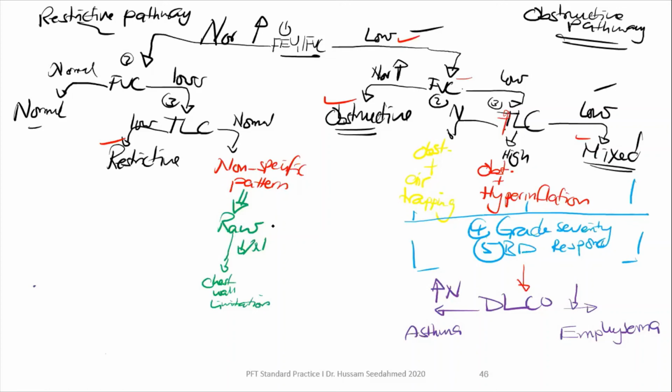أما إذا عملت ال airway resistance وطلع لي high طوالي ده حيتحول من non-specific حيبقى obstructive، لأن عارفين إحنا في الobstruction the airway resistance will increase. إذا أنا تحولت من non-specific pattern، بال airway resistance اللي هي الرو، مشيت إذا بقت high this is obstructive.